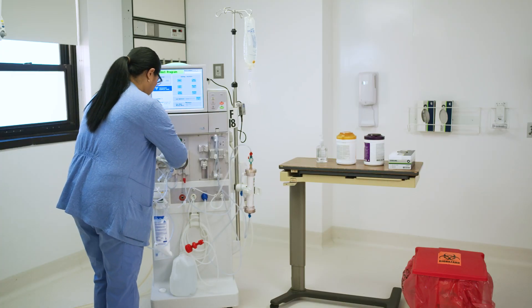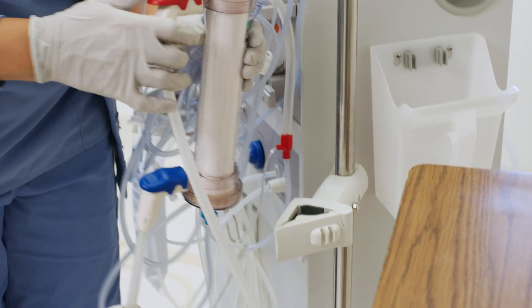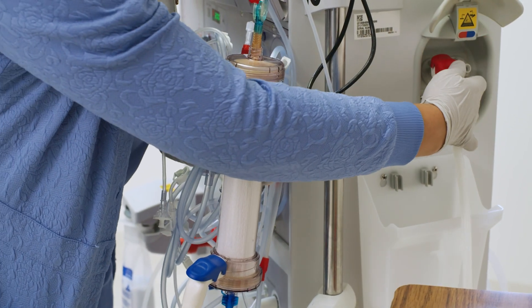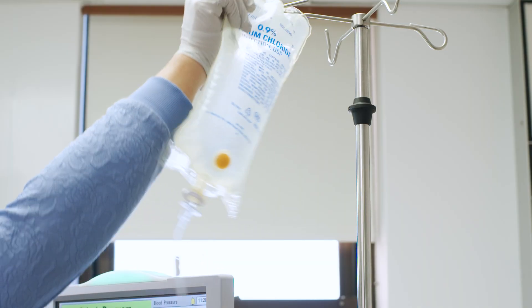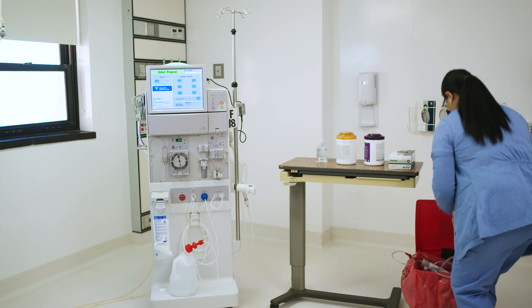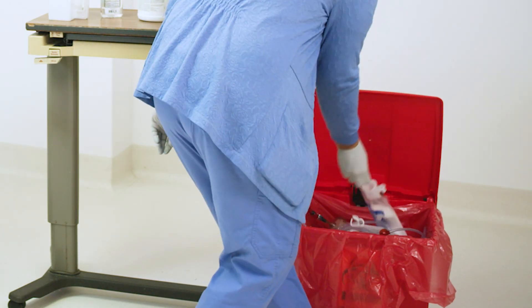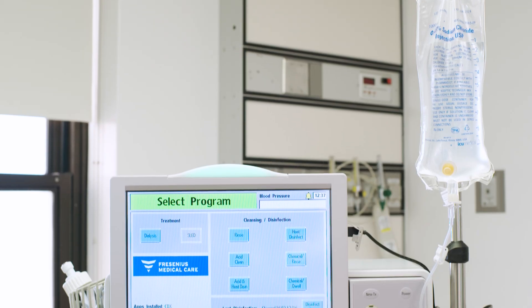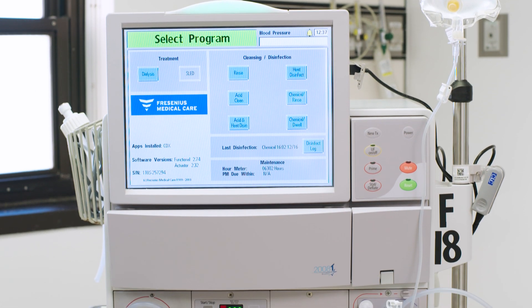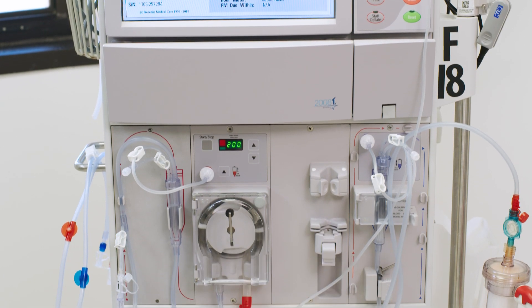Disconnect and take down any used blood tubing and dialyzer from the dialysis machine. Discard the tubing and dialyzer in a leak-proof container and dispose of any other single-use supplies. If there are any reusable supplies, remove them and make sure to clean and disinfect before placing in a common area or designated clean area for storage in order to avoid cross-contamination.